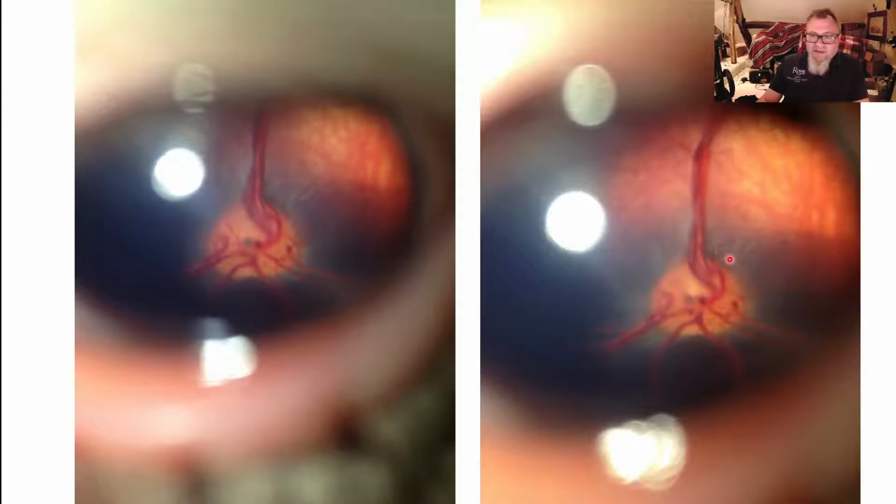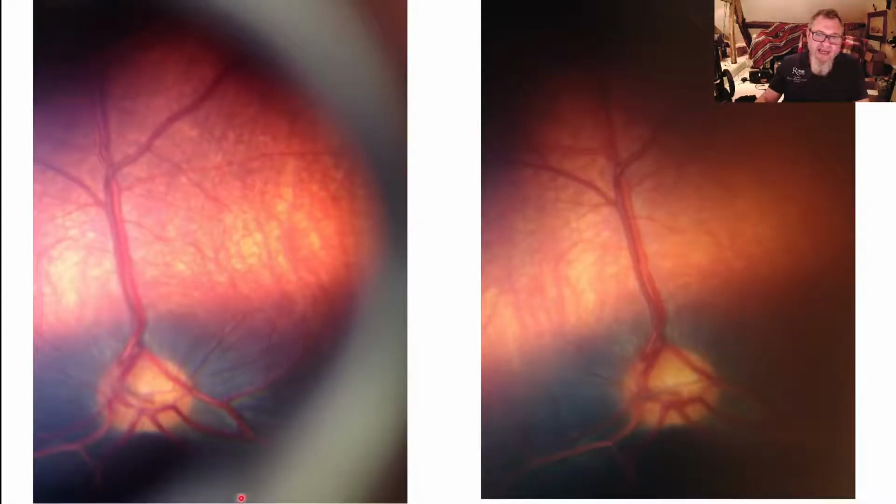And as we get closer, we will see more of the retina, and as we get closer again, we can see more again. We can still see some of the pupil, but this is the money shot. This is what we're aiming for. We're aiming to get close enough that there's no longer any view of the pupil, but then we can see the maximum view of the fundus, and this beautiful ungulate retina. You can see the retinal vessels curling around each other, which is typical of many ungulates.